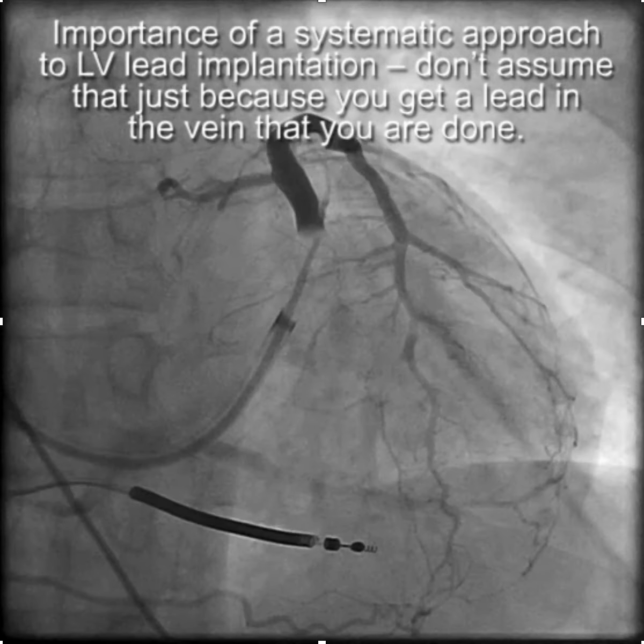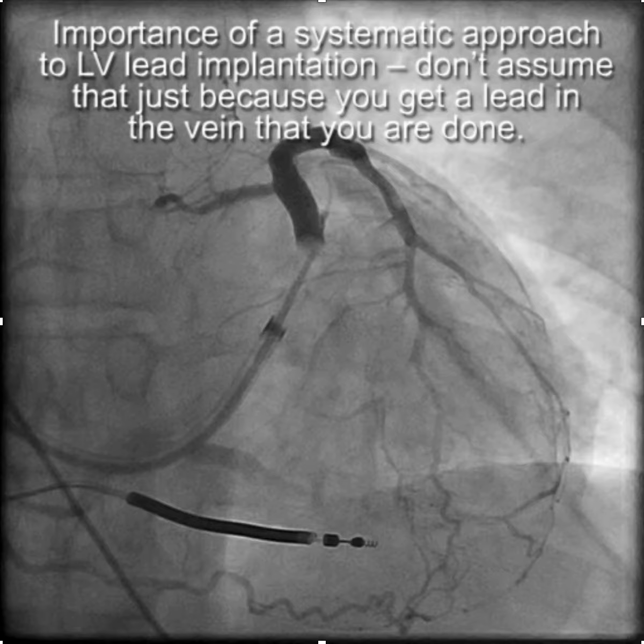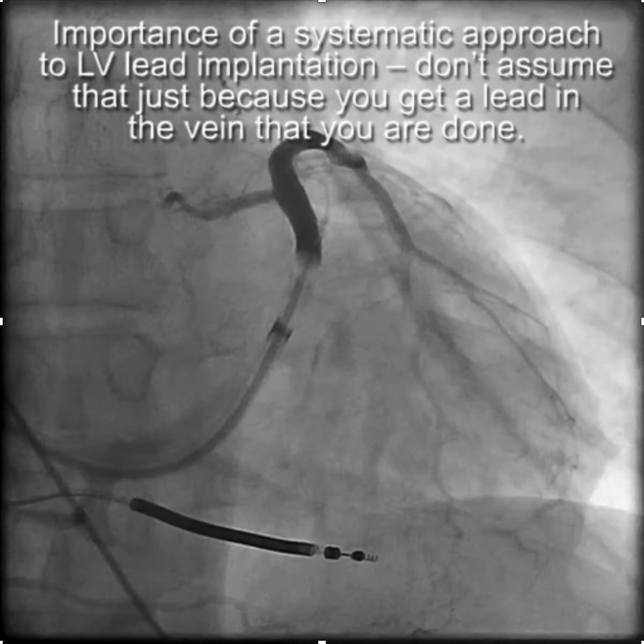This video demonstrates the importance of a systematic approach to LV lead implantation. You don't want to assume that just because you got the lead in the vein that your implant is complete.